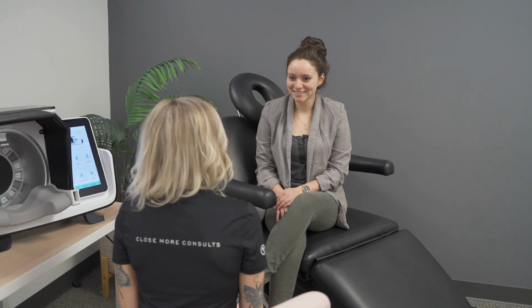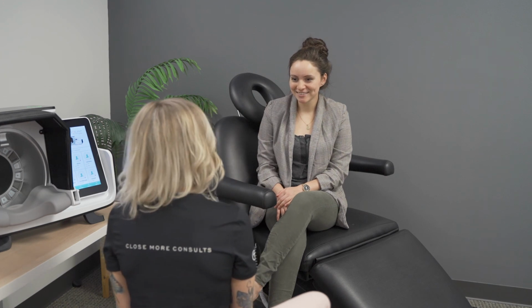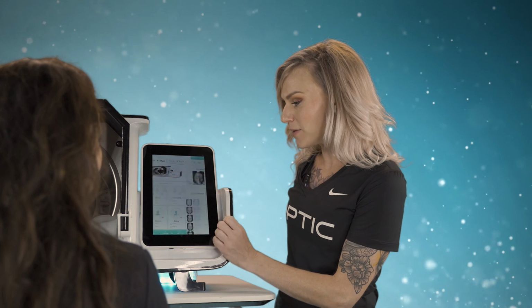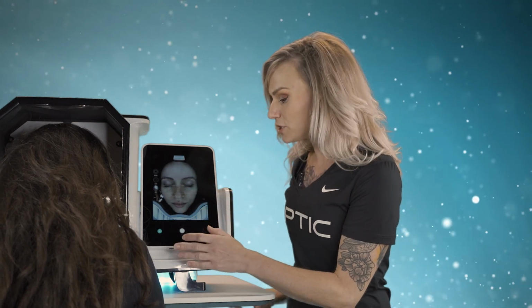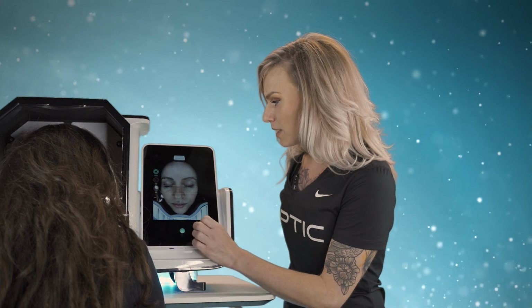Abigail, so nice to see you again. Your results look amazing. Let's go ahead and scan you in the Optic to get a before and after photo. I'm gonna go ahead and go into your file, and we can scan you again on new analysis here. So the camera is gonna light up. If you don't mind, press your chin right on that chin rest. Eyes are closed, forehead right against that. Hold still just for a couple seconds. I'm gonna hit that camera button just one time.